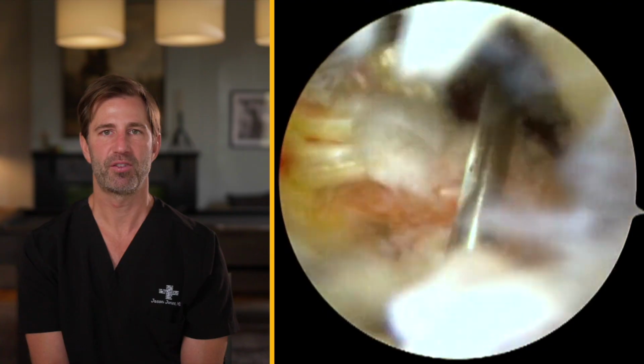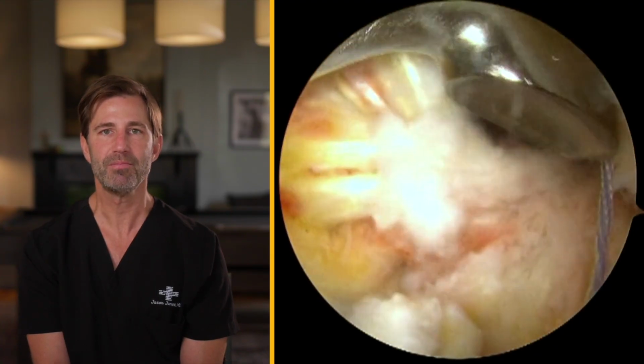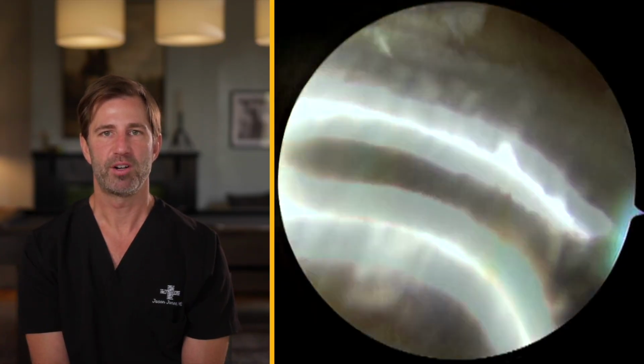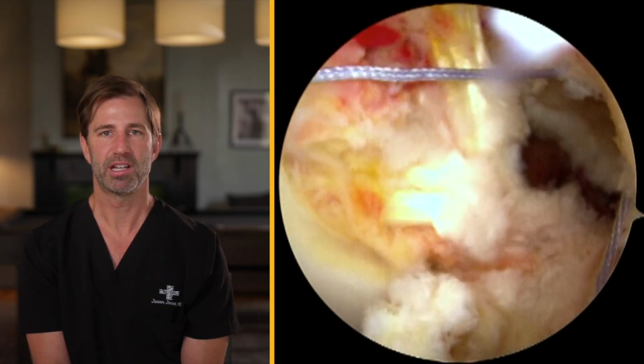In this way, we can pass up the new ACL ligament. This will be passed from the tibia and then will be lodged into the femur on the top portion. The diameters of both the tibial tunnel and the femoral tunnel need to be big enough to accommodate the new ligament itself.